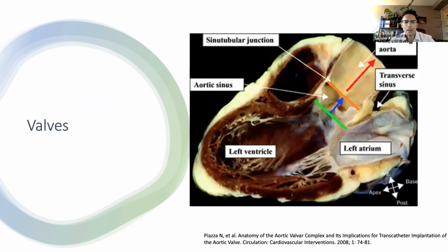And then finally, if we think about the valves, they can be affected by trauma and can significantly impair hemodynamics, especially if they affect the mitral or aortic valves, in which case they can be acutely destabilizing. So recognition of new valvular issues in the context of a trauma is extremely important to help optimize the resuscitative strategy.